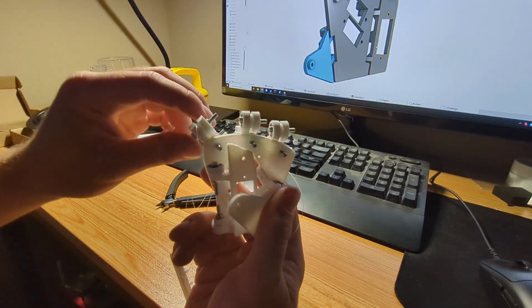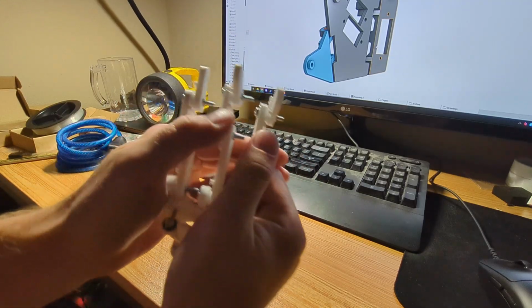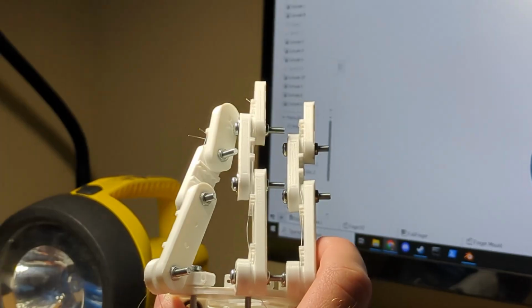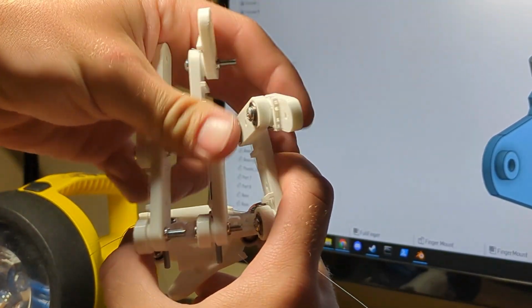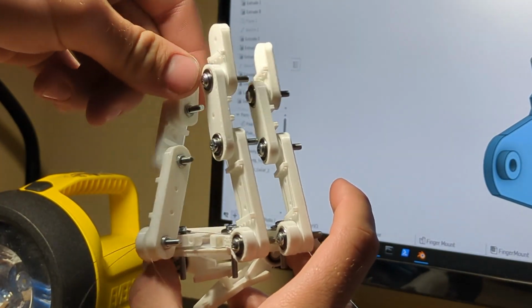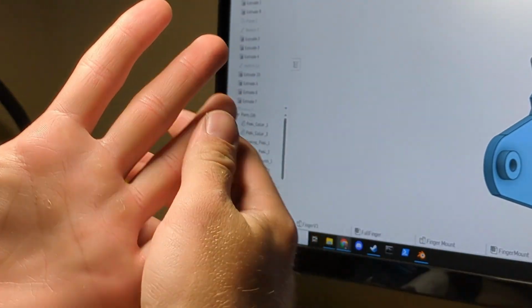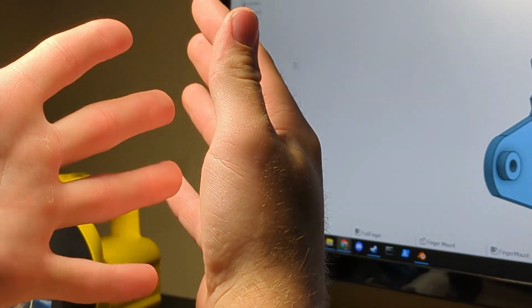Now, with the current joint configuration here, if you move the fingers vertical, I'll show from this angle too, and you splay, they don't splay, they actually twist, which looks very unnatural and will probably perform differently. Okay, one more time from a slightly better angle. You bring the fingers up, and if you attempt to splay, it doesn't work. They simply twist instead of splaying, which is just not what your hands do. Bring your hands back and try to splay, the splaying still happens.